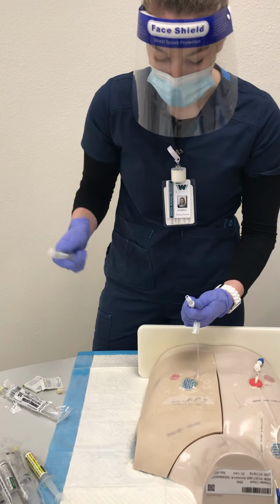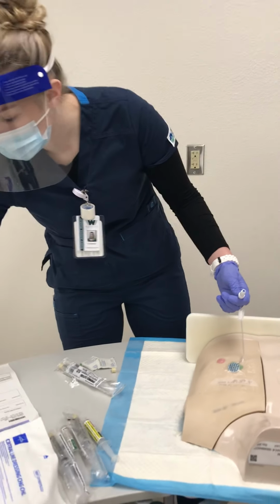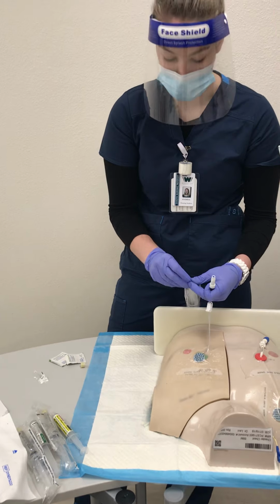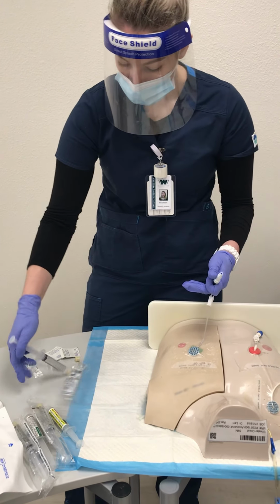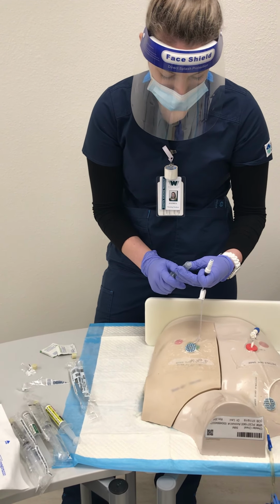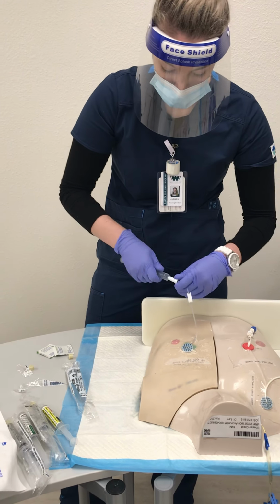So then I can hand this to the lab tech, and she can take it and label it and take it down for that test that the provider's ordered. And I've kept this above and not touched it, so I don't need to re-clean it. So I kept it clean. And then we need to flush one more time. So we'll attach that.